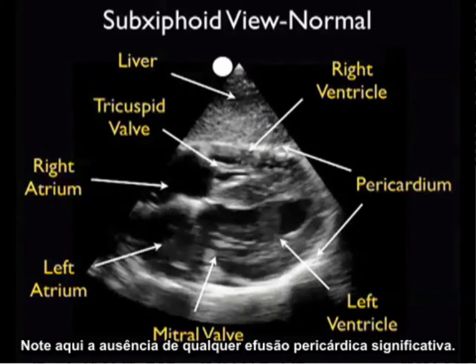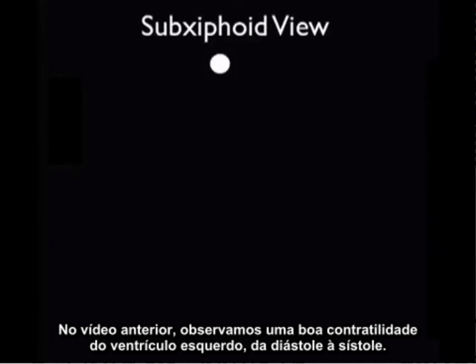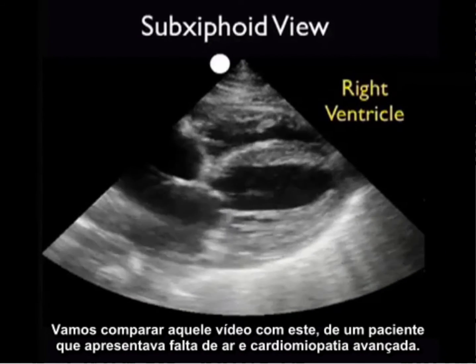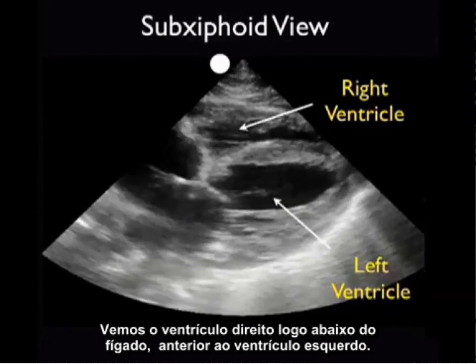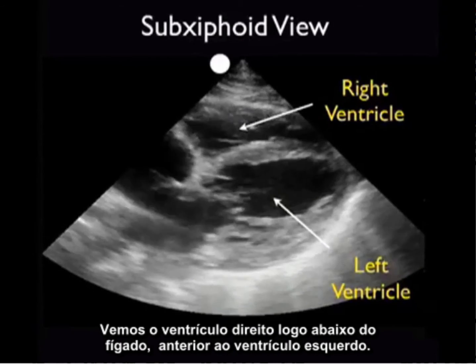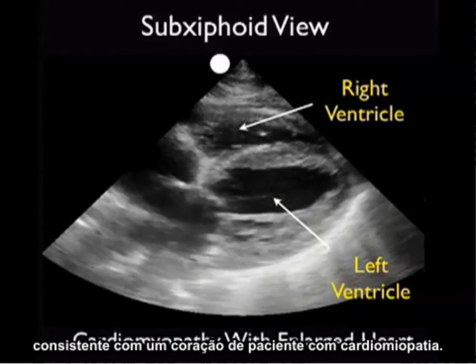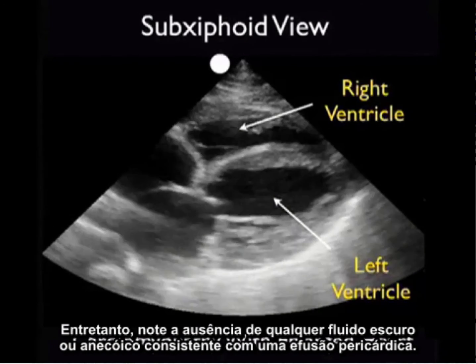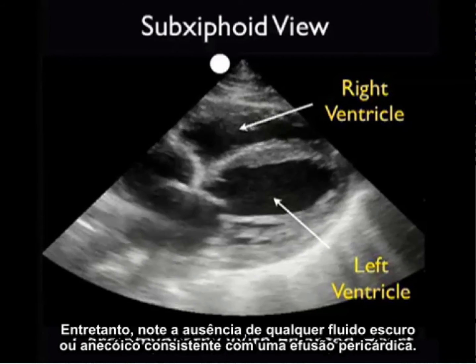Note the absence of any significant pericardial effusion. In that last video clip, we noted good contractility of the left ventricle from diastole to systole. Let's contrast that clip to this one from a patient who presented with shortness of breath and advanced cardiomyopathy. We see the right ventricle just below the liver, anterior to the left ventricle. What we see here is a poorly contracting and dilated left ventricle consistent with a cardiomyopathy heart. However, note the absence of any significant dark or anechoic fluid collections consistent with a pericardial effusion.